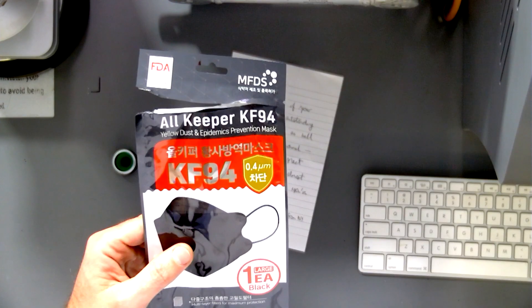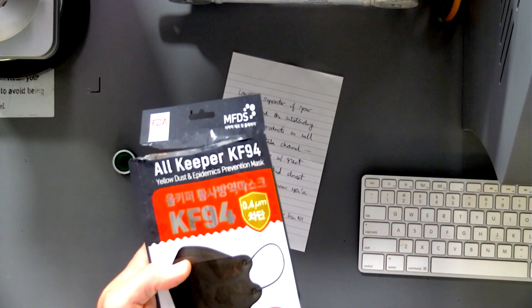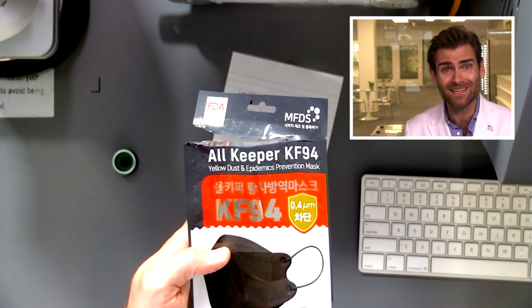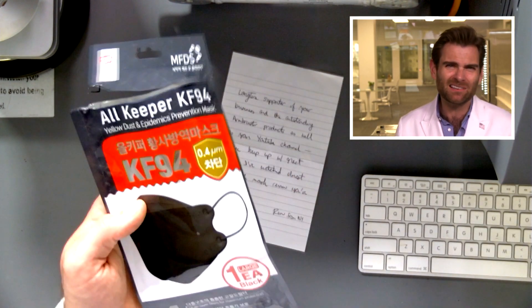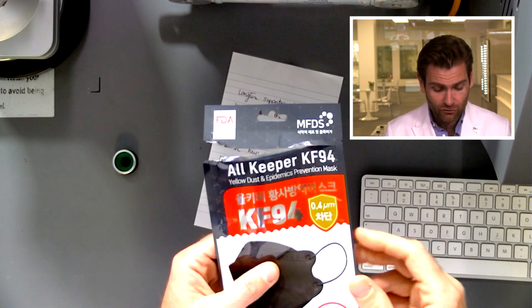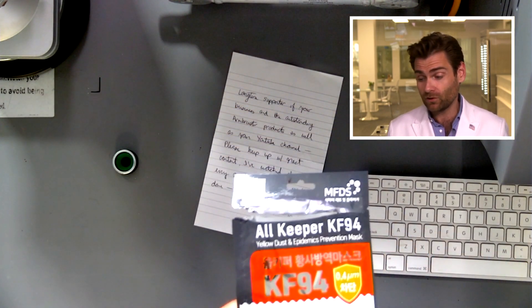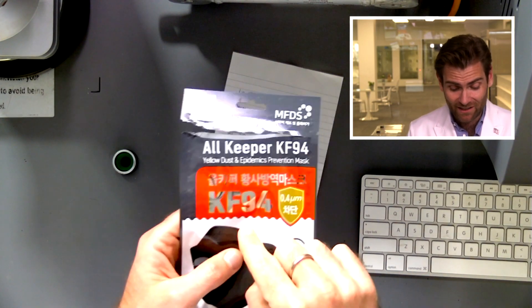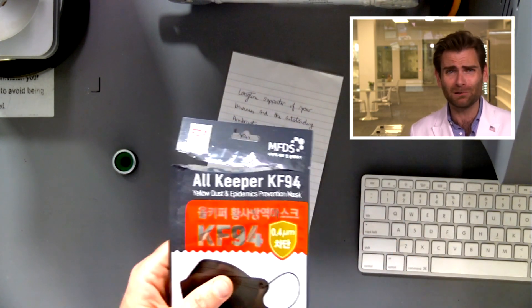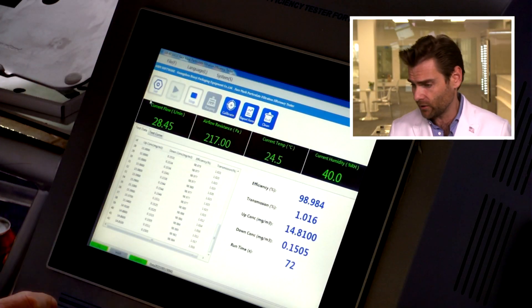This must be part of the MFDS standard — they're testing at 0.3 or 0.4 microns, whereas our test uses 0.3 microns because NaCl particles are about 0.3 microns. We're not doing the exact Korean test — KF94 means 94%, that's what they're claiming. I've never seen anything with a KF94 and MFDS logo that tested below 98 or 99%. Let's just go ahead and do this live.